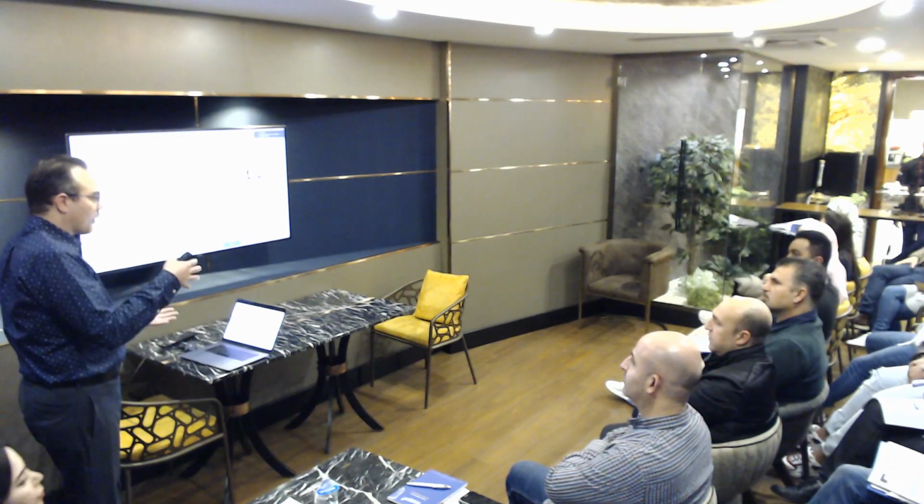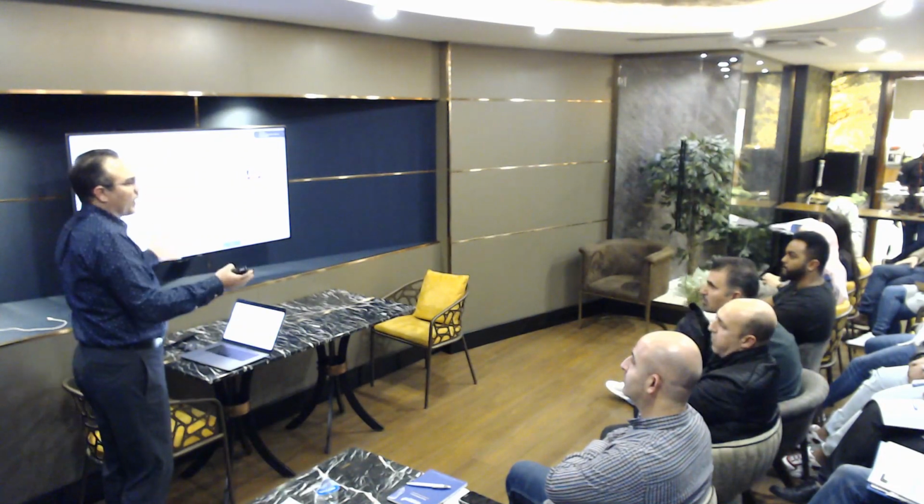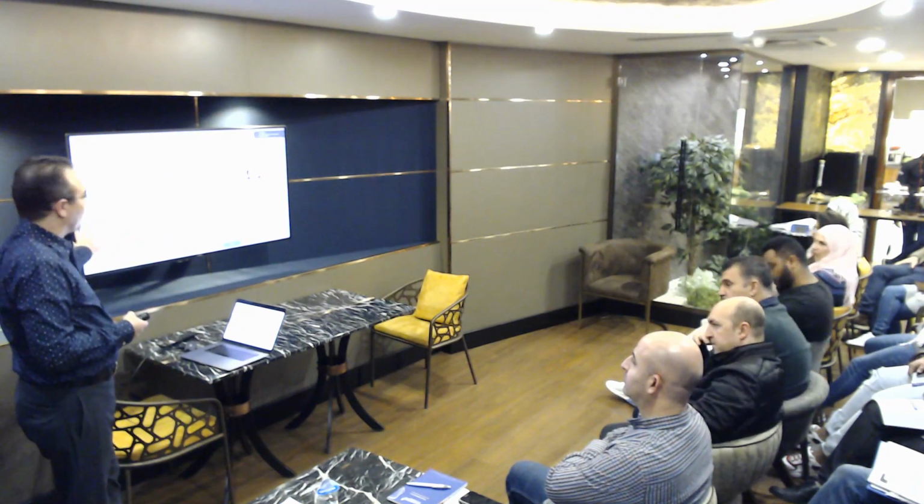Now come to the deep bite, the overbite. Whether you have an open bite or a deep bite, how do you want to deal with that? The first option is just leave it, or just do the alignment and see what you are dealing with. Usually this is what I go with, unless I'm dealing with a severe open bite or a severe deep bite from the very beginning, and that is my goal of treatment. Otherwise, we talked about the mechanics.